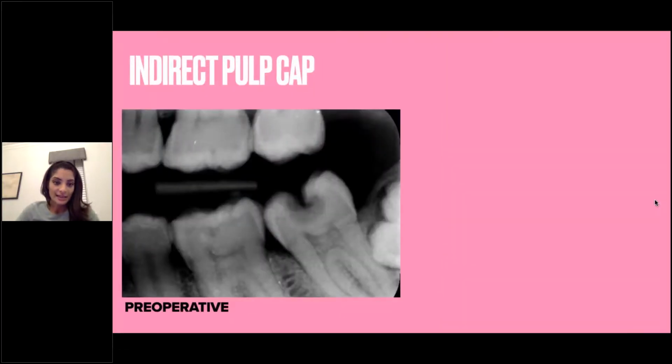So we're going to look at this case together. This is a patient that I saw. They had a caries here. They had other carious lesions as well that their general dentist was going to deal with, but they were really referred to me for this one down here. Again, the patient had symptoms of reversible pulpitis, and because the caries is quite close to the pulp, it was a case that I typically would think, okay, this needs Biodentine.